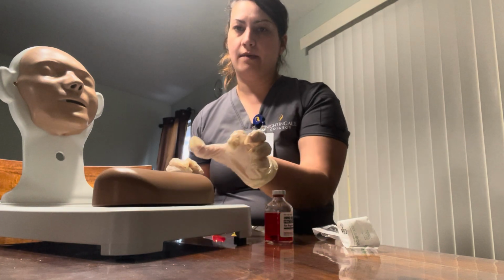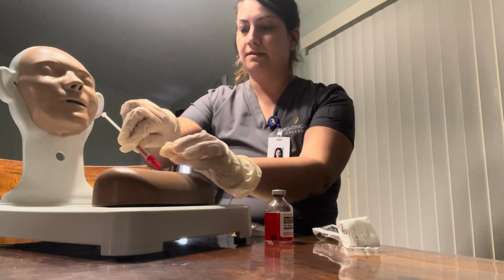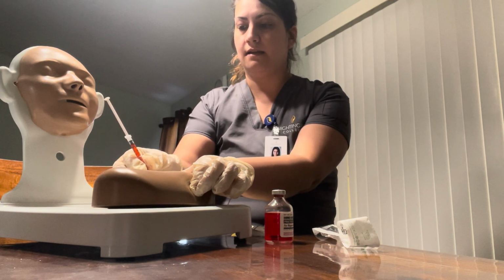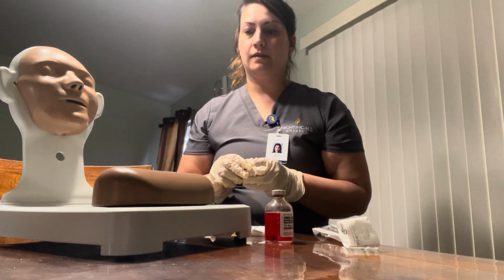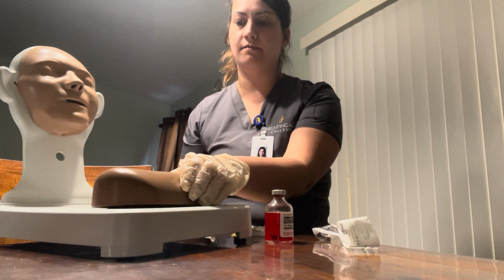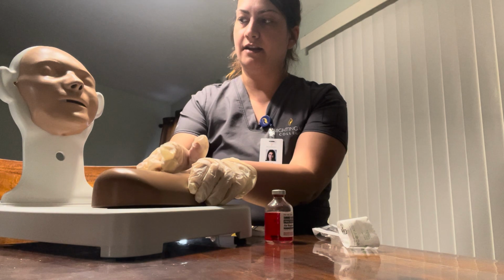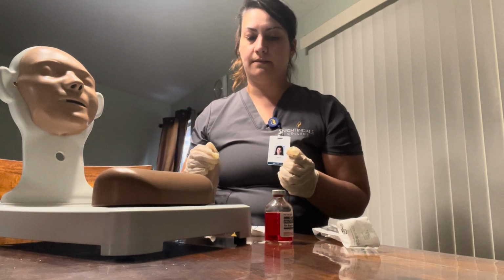I will grab and make sure that I measure it top to bottom, that the needle is 1/2 inch in, which it is. And we will assess for any inflammation, any edema, any infection. We will palpate for tenderness or masses. Any tenderness here? No? Okay. So this is the site that we're going to be injecting.